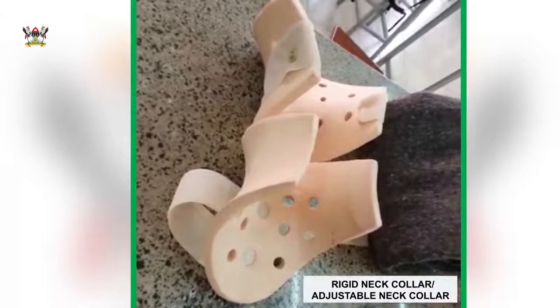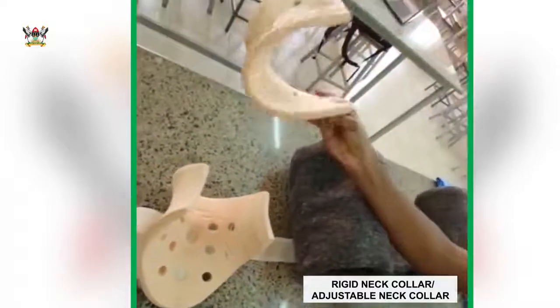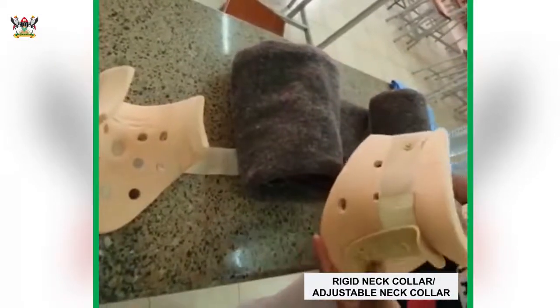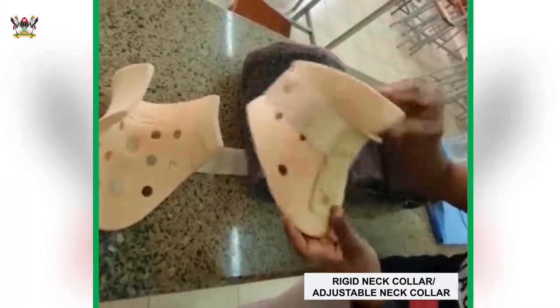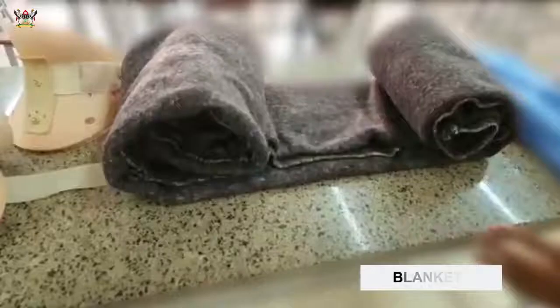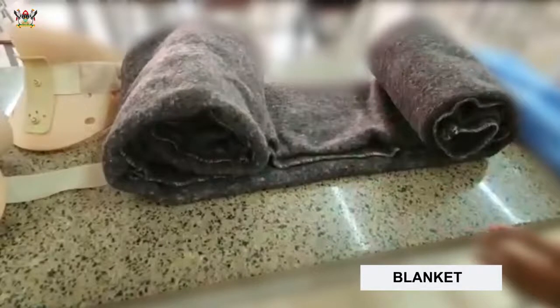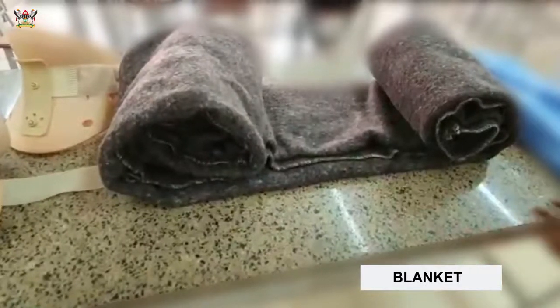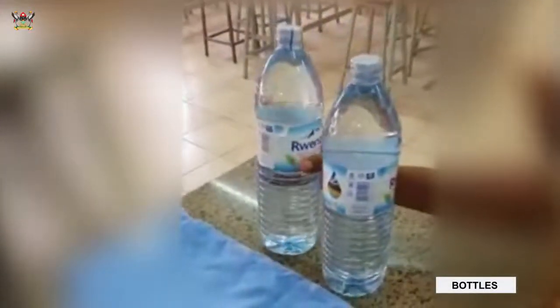The collar has a front piece with a curvature to accommodate the chin, and it has a back part. However, in instances where we lack the proper rigid cervical collar, we can improvise with a blanket or a bed sheet and rigid objects — for example, two mineral water bottles to create rigid objects that can stabilize the neck.